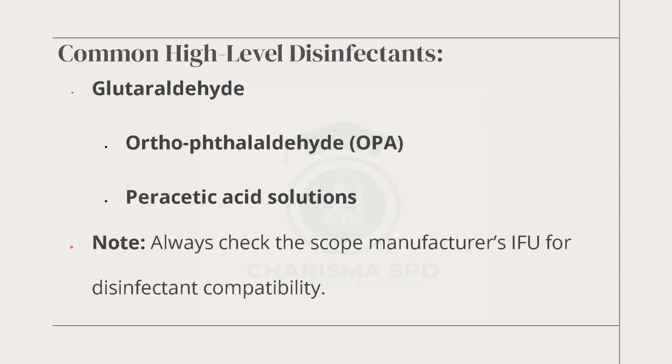Let me make this general rule. Regardless of which of these high-level disinfectants you use, if it is manual, you have to rinse the instrument thoroughly, because if there is any residue left on the instrument, it can cause harm to the patient. When you are setting it up, for example, the OPA is set up for, I think, 2 weeks, 14 days. Some of them you need to dilute, some you don't. The OPA, you don't dilute it.